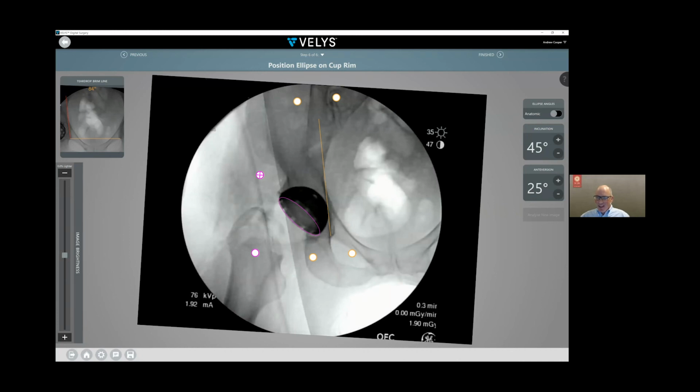Do you want your tilt to match your standing X-ray, your supine X-ray? It's ironic that we put our cup in either lateral decubitus or supine. And I can tell you supine position is not really where my patients are going to dislocate. They're probably going to dislocate when they sit or stand. So we analyze a cup in our supine position. We pat ourselves on the back and say it's a great cup. And it may be, but there's a missing piece here. What is our cup going to look like in these extremes? There's a lot of technology already out there that addresses tilt. And I think that is the next phase of this technology, where we can really help you with, all right, here's what your cup looks like right now, but let's make sure that you're happy with what it's going to look like in all settings.